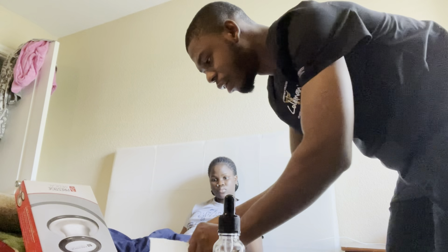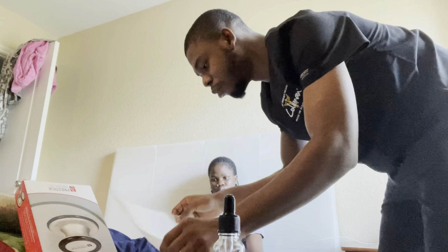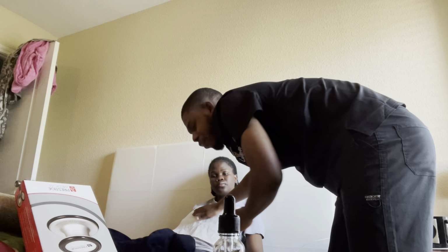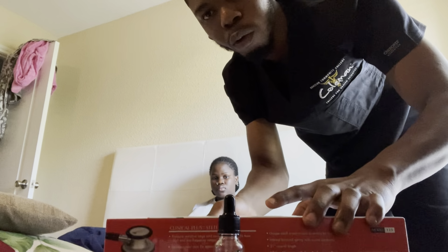After that, I will take my drape and I will place it. If there is any drape available, I will place it over the patient's chest. I will take my suctioning kit. I will open my suctioning kit.